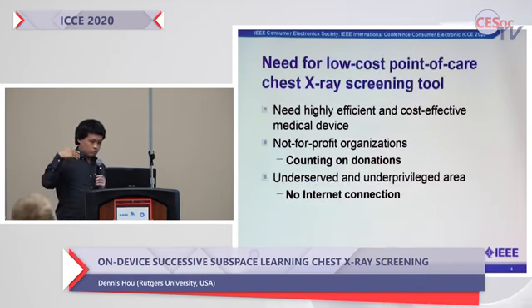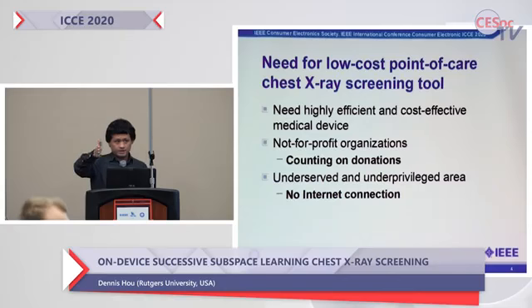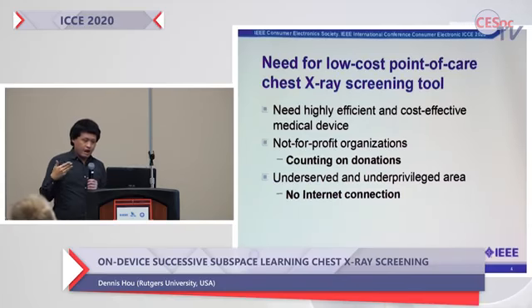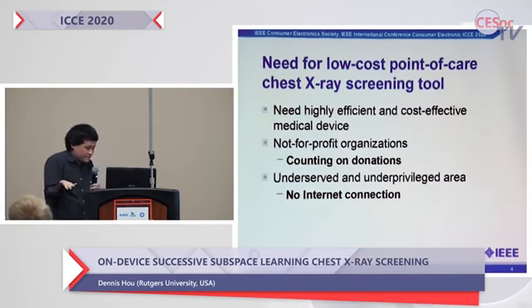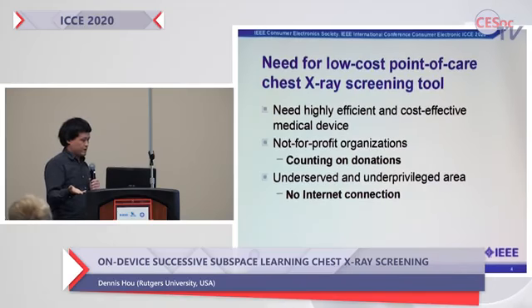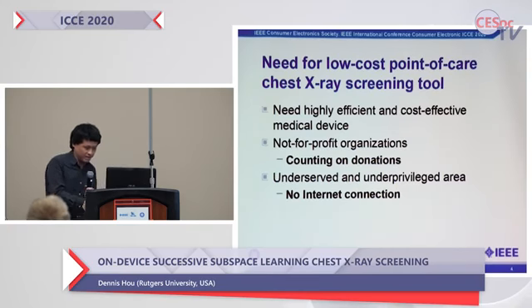Okay, so the need for a low-cost screening tool, and this would just be sort of the first stage. And then after this, you kind of have to move on to other things to try to rule out other potential differential diagnoses. But essentially, you have a lot of situations where you have nonprofit organizations. Nearby, there's a homeless shelter in Nevada that has this kind of problem where they have no funding and they'll take anything.